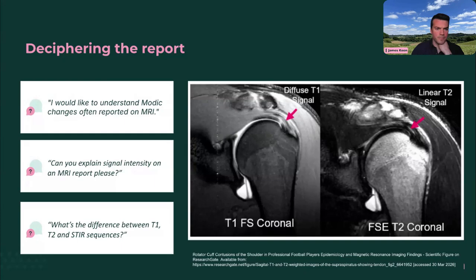And I think there was a question I'd seen in advance of this talking about stress fractures and maybe occult fractures. STIR and fat saturation techniques in MR can add a lot of sensitivity to edema in particular. So if you're looking for any kind of microtrabecular injury, STIR or fat saturation techniques, proton density fat sats, are going to be really sensitive to picking up those types of things, and you'd then typically ally them with a T1.